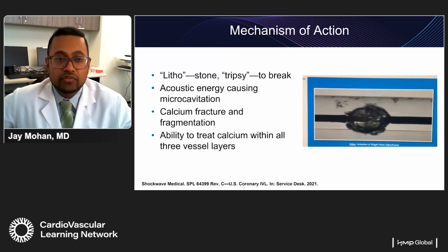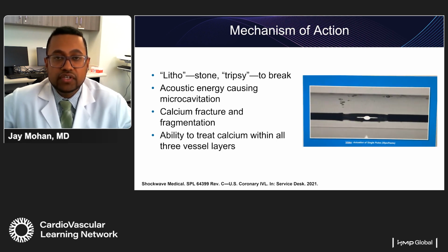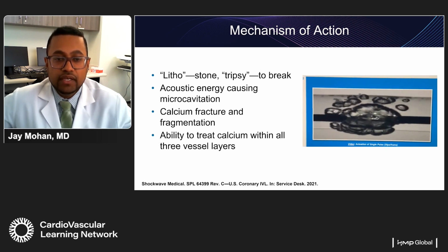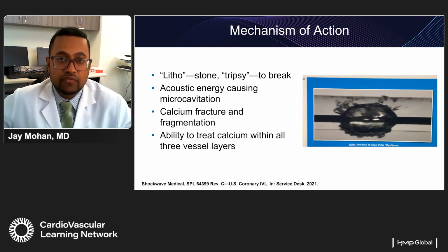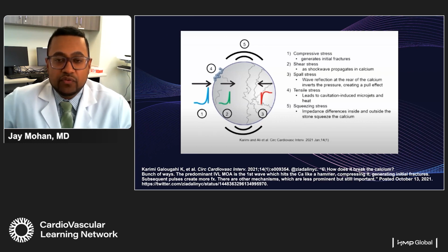The word lithotripsy comes from the Greek, meaning stone or to break. It's using acoustic energy, or sound waves, to create microcavitations to break calcium. And what's really unique is that it treats both superficial and deep calcium. That's the first time we've seen that. So I think this was really explained well.